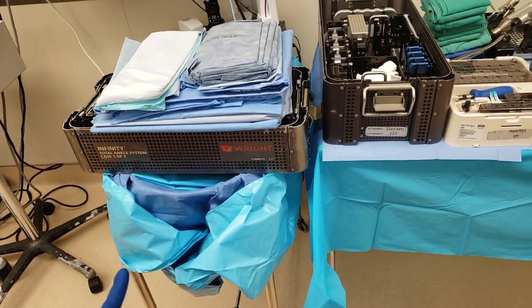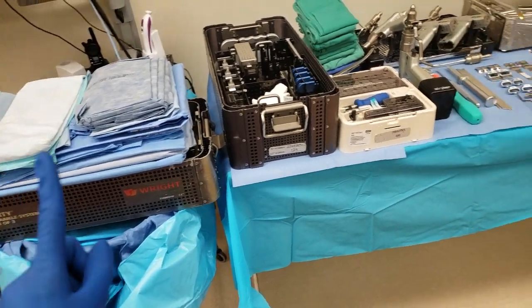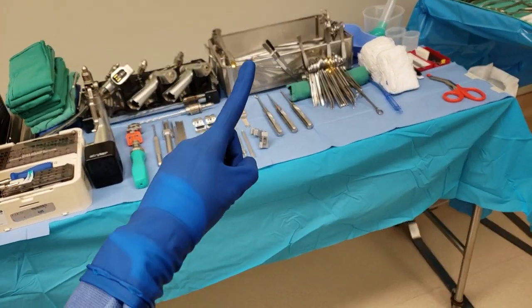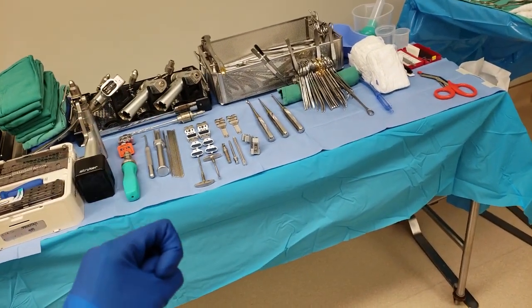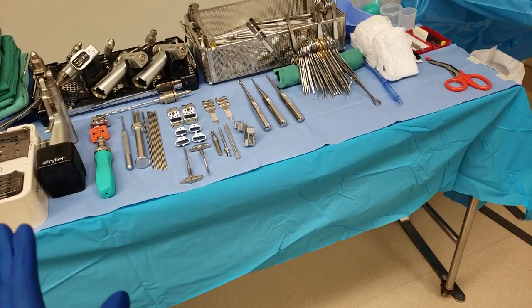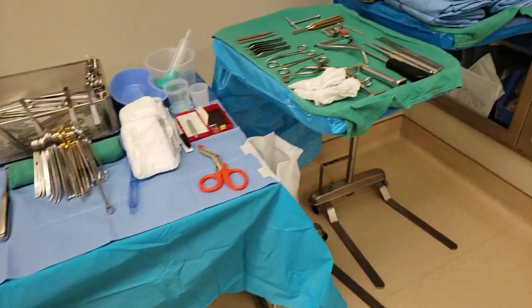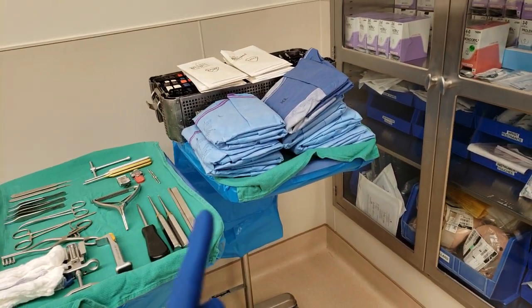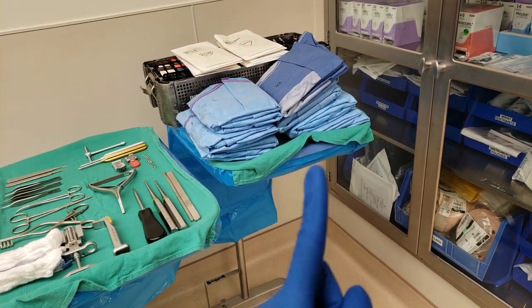So I used the ring stand to put one of the trays, consolidated some of my instruments, and instead of getting the tray out, I kind of just took all the instruments out and then just lay them all out. When you're done, put them back. I have an extra mayo here, which I put the other tray over there, and I'm gonna free up this space once I gown and glove everybody.